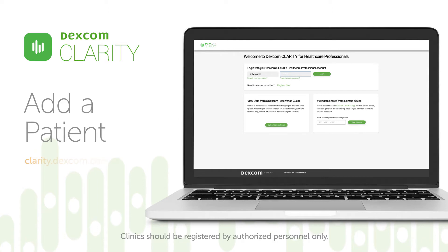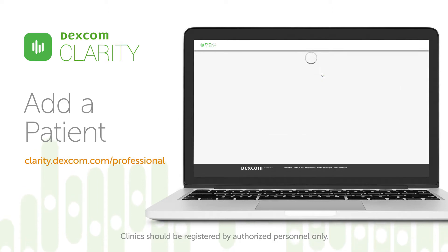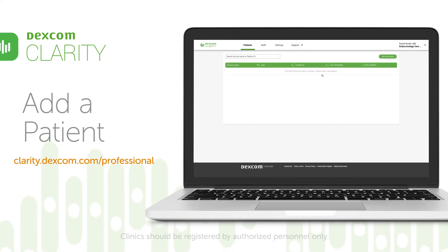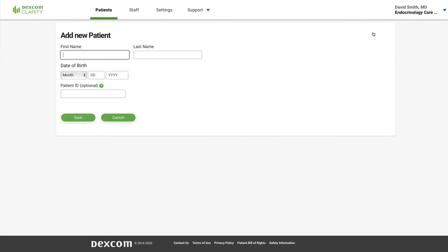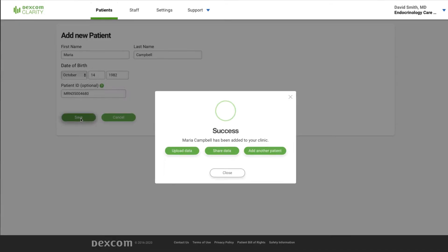Log into your account at clarity.dexcom.com/professional. Click Add New Patient. Enter the patient's name, date of birth, and optional patient ID, then click Save.